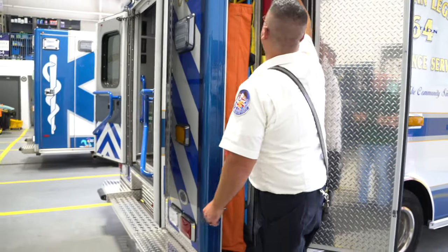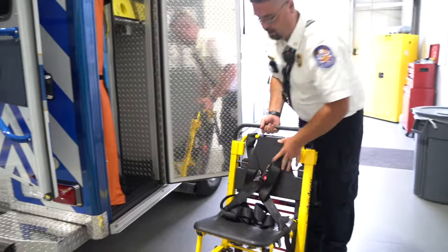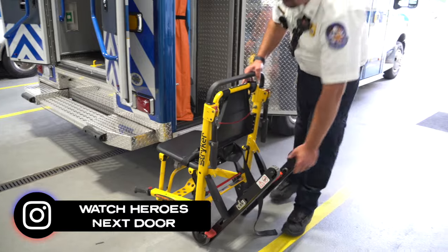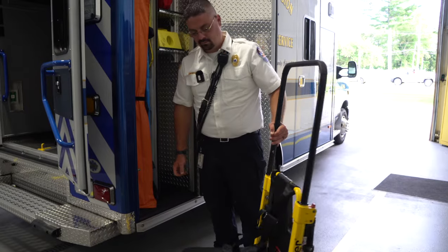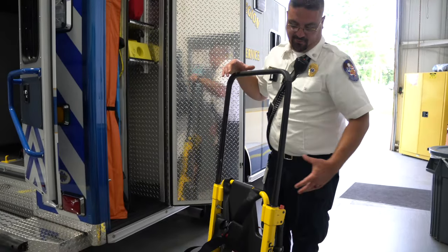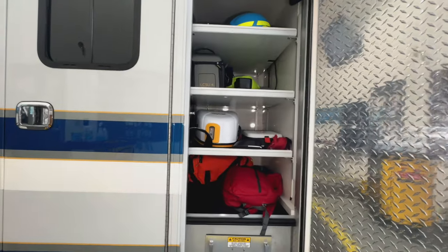The yellow thing below is a stair chair — it's a chair with rollers on it. If somebody is upstairs or downstairs, they can be safely secured into it, and it has tracks that allow us to roll down the steps safely without strain on our backs or compromising patient safety. Each step is smooth — the friction slows the chair going down so you're not just sliding.